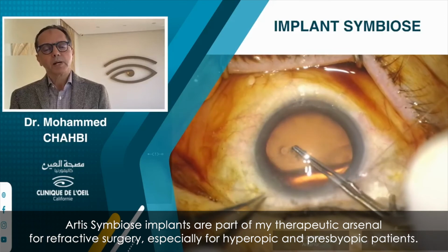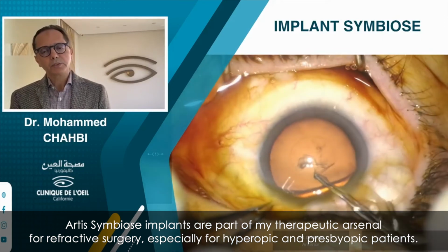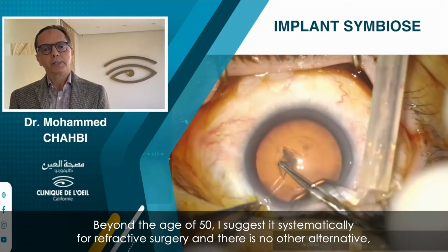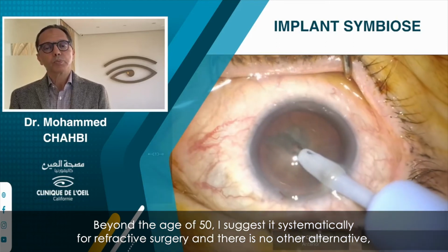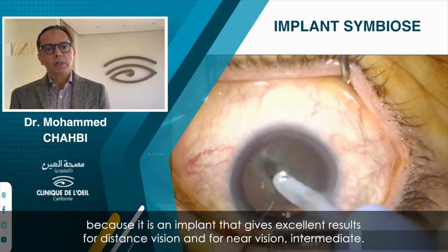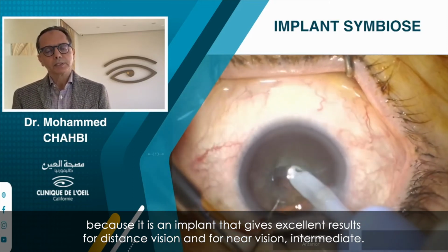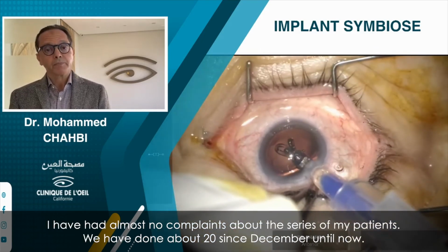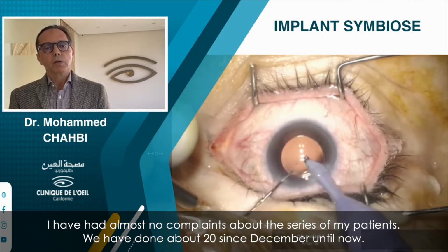Artis Symbiose implants are part of my therapeutic arsenal for refractive surgery, especially for hyperopic and presbyopic patients. Beyond the age of 50, I suggest it systematically for refractive surgery and there is no other alternative, because it is an implant that gives excellent results for distance vision and for near and intermediate vision. I've had almost no complaints about the series of my patients. We have done about 20 since December until now.